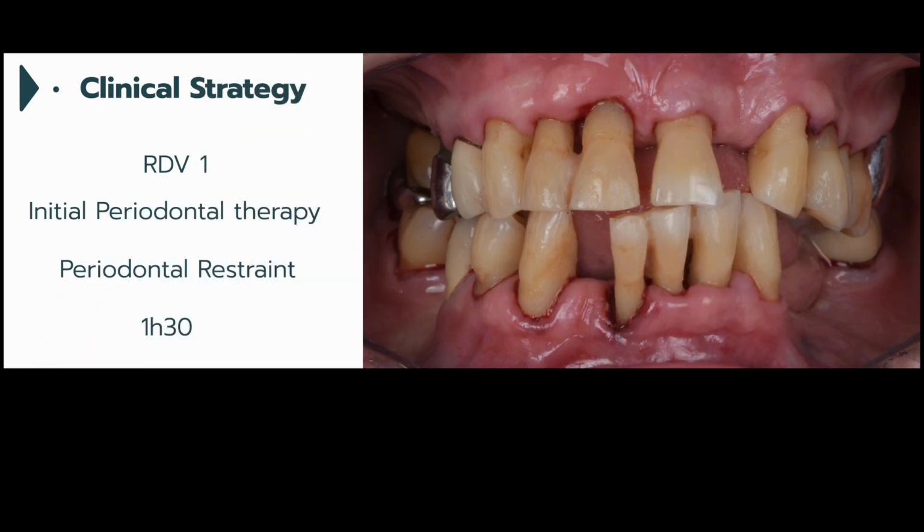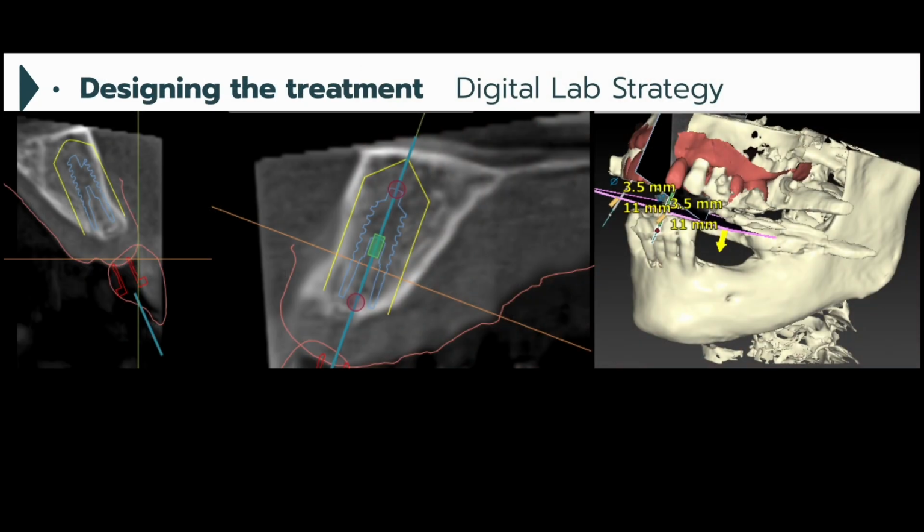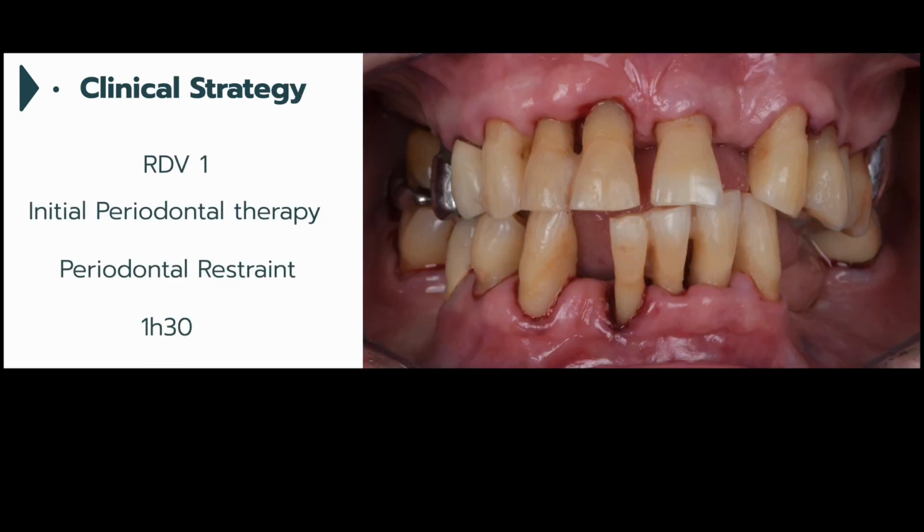I will go for it with my guided surgery in a good situation. And we can check with this kind of treatment the healing of the patient. Will he be able to have a good healing for the gums? And you can see here, thanks to the second picture, that we can see the difference between the first one we saw in the first consultation and that one after maybe 6 or 8 weeks, no more. Yeah. And the patient education to periodontal maintenance, yes.